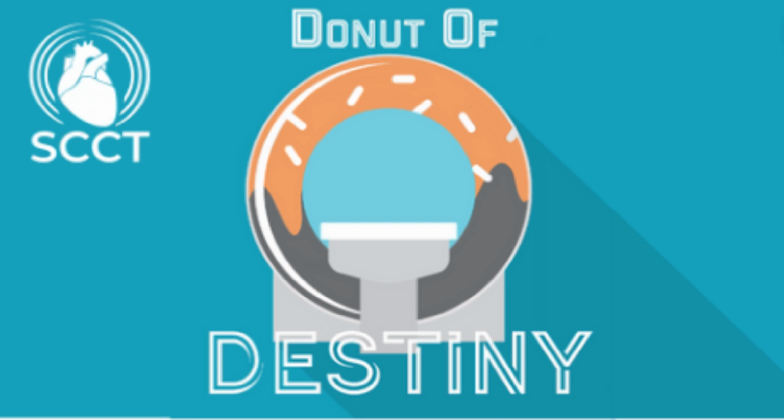And Charlie, I guess that begs the question, in the low VM group, what's driving that? Is it the low volume within the vessels, or is it the fact that these patients have a high myocardial mass? Yeah, it's a great question. And when we looked at the data from NXT, of course, it was a smaller study, so we saw a lower volume and a lower mass, for example, with women.